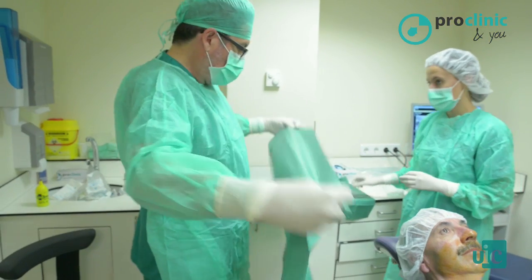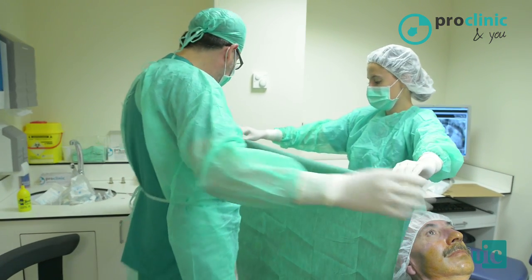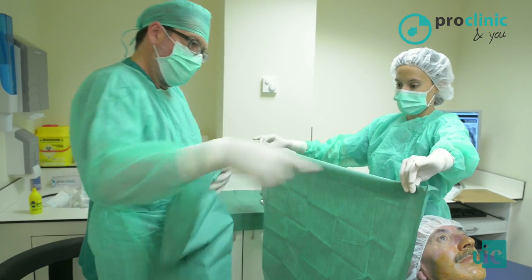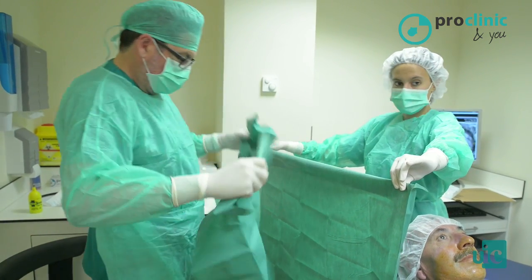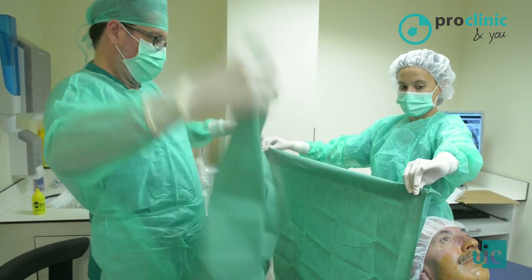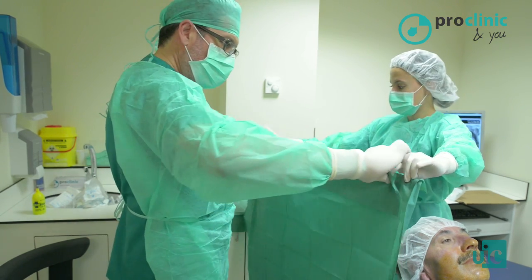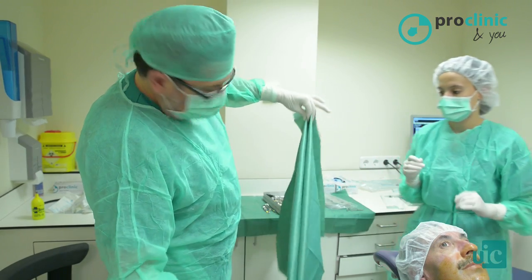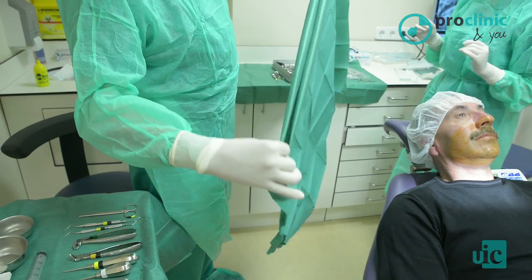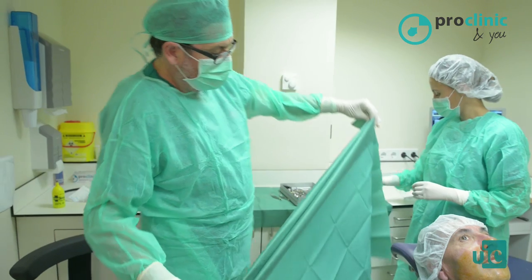We are going to cover the patient with sterile towels. Look how I arrange the towels to cover the patient's head. We have folded a towel out and folded in another towel. Can you see it? This would be the position. We place the index finger between both towels. The thumb goes inside, and the rest of the fingers go outside.